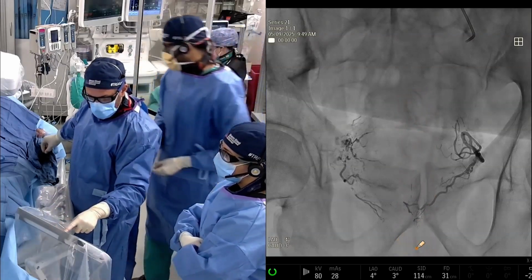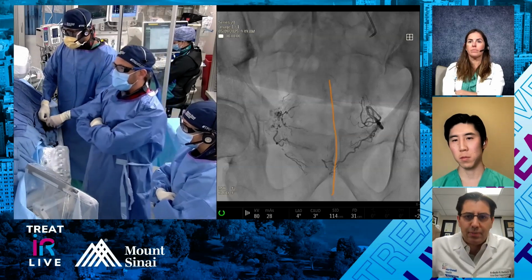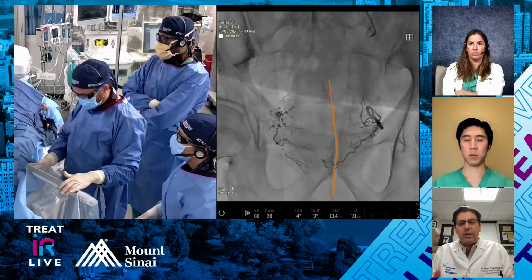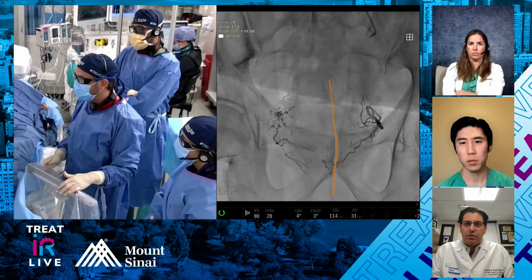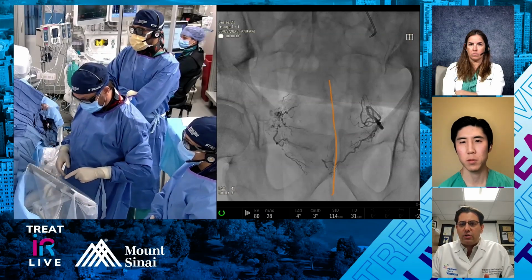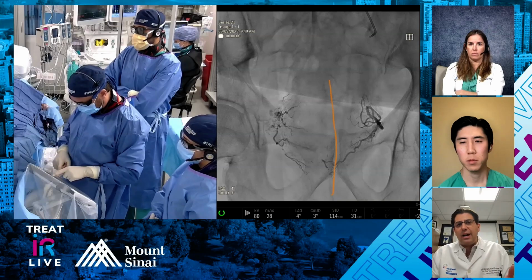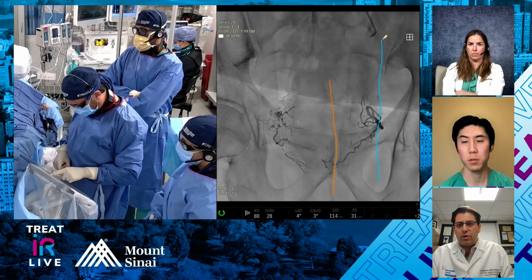In the beginning, we did the cases, and then patients would come in, and are they going to have a good response or not? Then we realized that the degree of penetration really matters, because in the beginning you may not get great penetration, and we call that a level 1 when only the main PA is occluded. 2 is like halfway across the central gland, 3 is all the way to the midline. And then you can have different degrees, which I did not differentiate in our original paper because we didn't see a clinical difference in those groups.